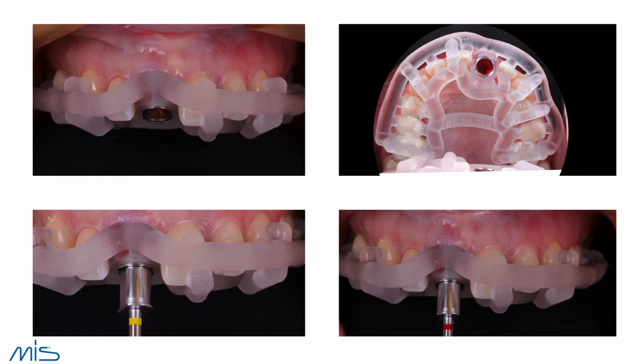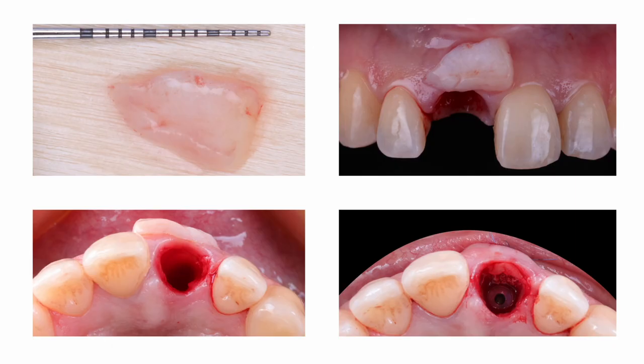Here is the drilling sequence: for the red drill, I'm not going to use the full length — I'll use a shorter drill. For instance, if I place an 11.5 mm implant, I may drill to only 8 mm. Then we're going to use the connective tissue graft to compensate for the shrinkage from extraction.